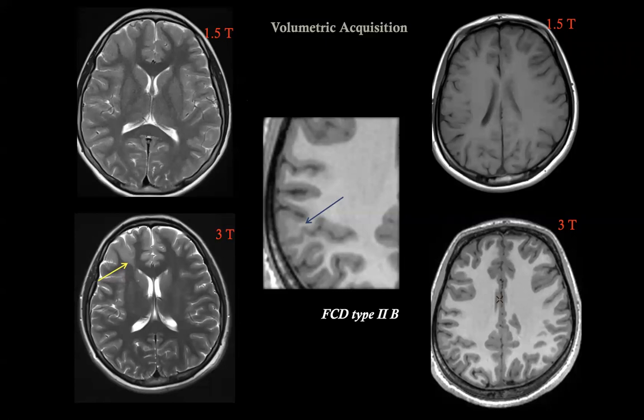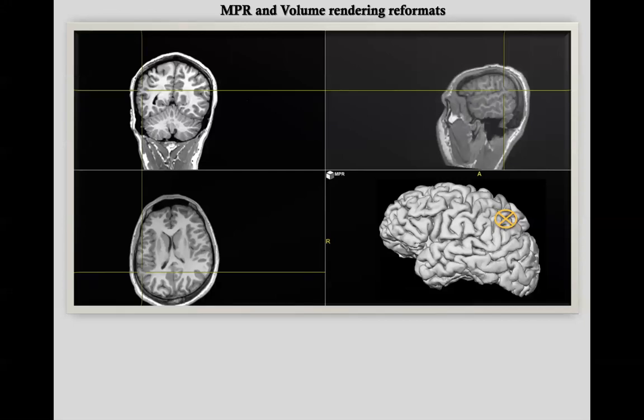So the bottom line of that is really you need to sit with your physicist, you need to try and try again till your sequences, whatever scan you have, works very, very well. Another important thing to have 3D sequences is that actually you can do surface volume rendering.